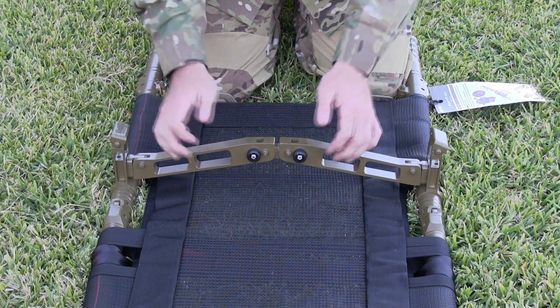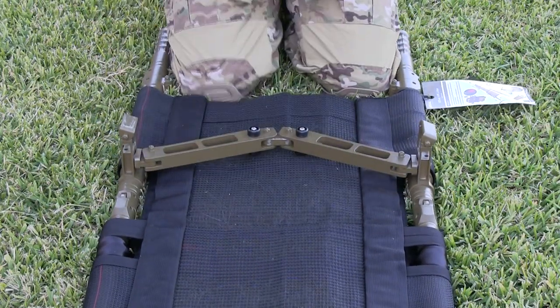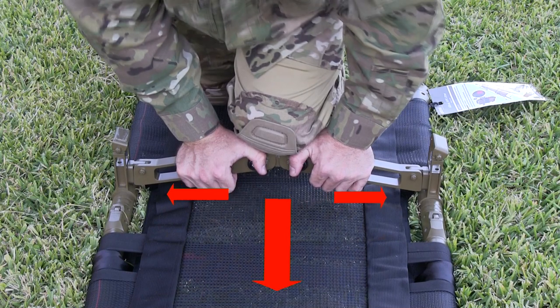To release the locked spreader bar, you must place weight on the top center of the spreader bar to push it downward while simultaneously sliding both of the black buttons toward the outside frame of the litter.